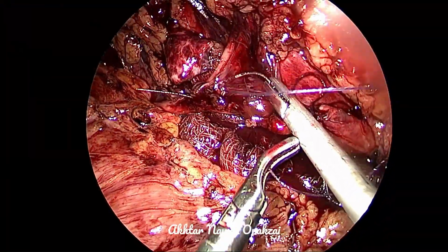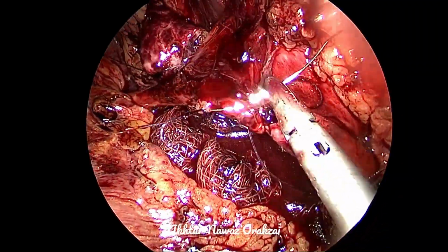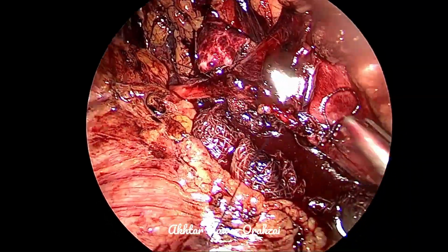So after a week, when the anastomosis has sealed, we'll remove his catheter, and the DJ stent can remain there for another 3 weeks.